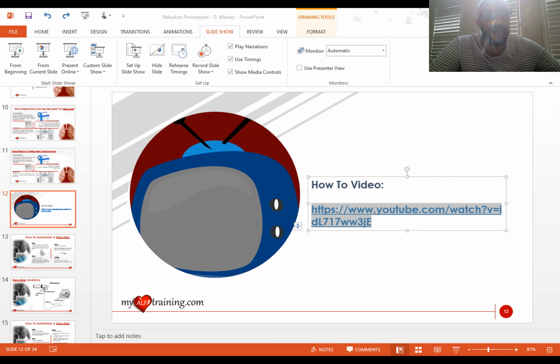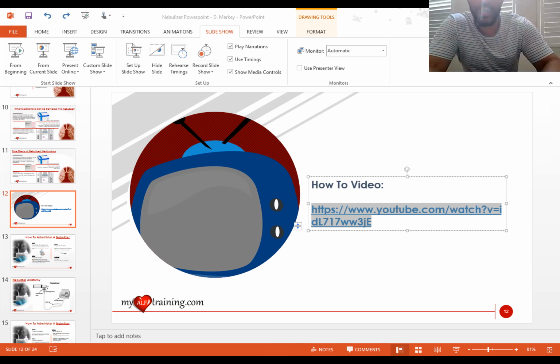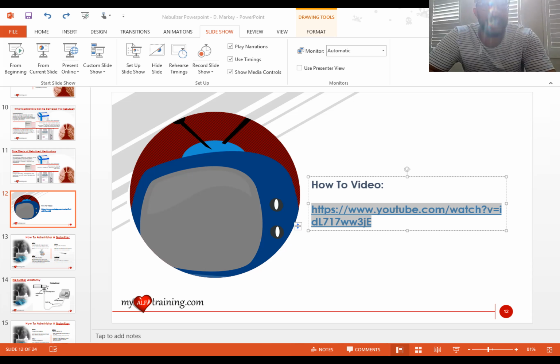So if it's tilted away from the port, then as I showed you guys with our quick physics lesson, the medication isn't being turned into small enough particles to allow it to flow with either the oxygen or whatever you're using to push the medication through into the lungs. So it's very important to remember that when we are trying to administer medication to the patient. So let's continue.